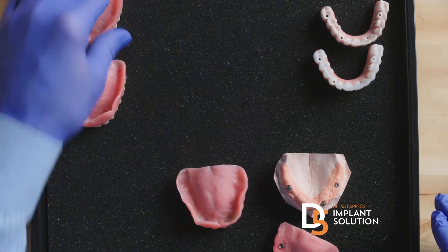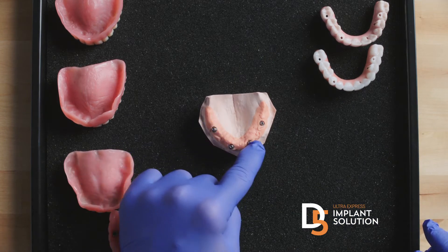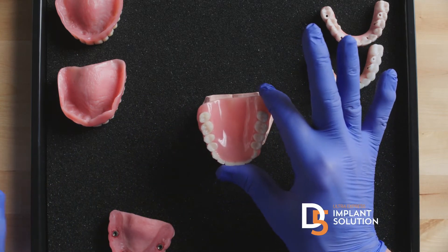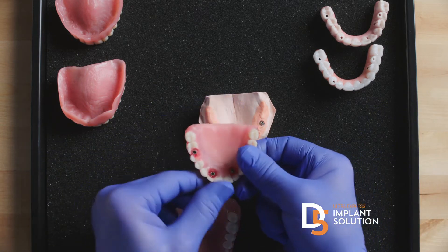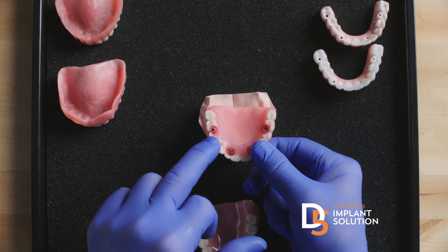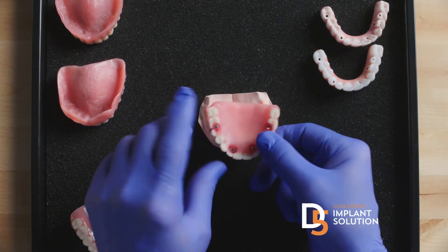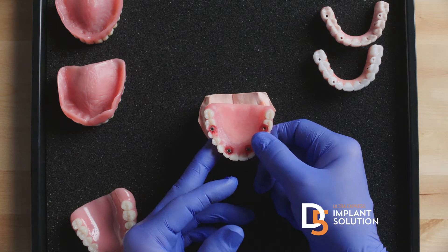At a teeth-in-the-day center with the traditional approach, you take out the teeth, you put the implants in. Because the denture wasn't precisely made before — since you didn't know where the implants were going to be — you just screw in temporary cylinders and start drilling holes in the denture. Then you take plastic and inject it between the temporary cylinder and the inexpensive plastic or 3D-printed denture. At the end, you basically just have a simple temporary denture that screws into the implants.